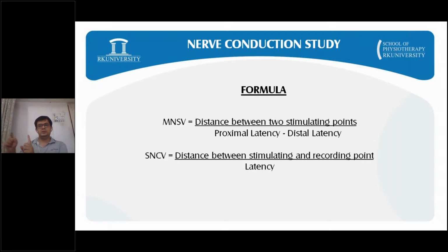So in short, why we are taking 2 points of stimulation is to avoid the residual latency.